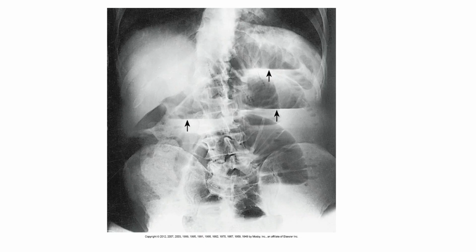So that's what we're seeing with this horizontal line. We're not really seeing refraction so much as we're seeing a difference in absorption between liquid material, water-based, hopefully, and air, that is air bubbles in the colon.